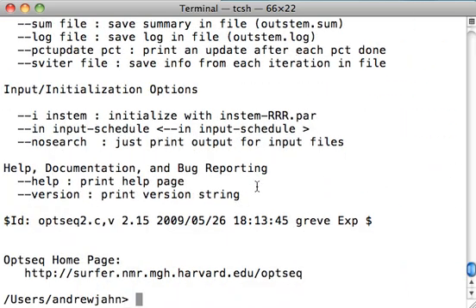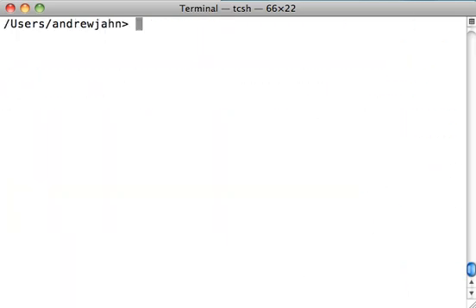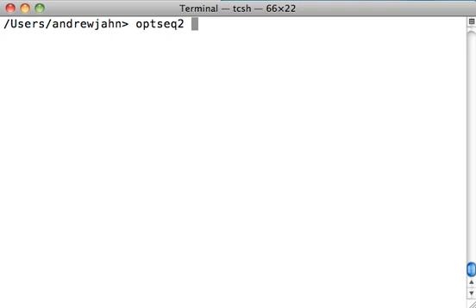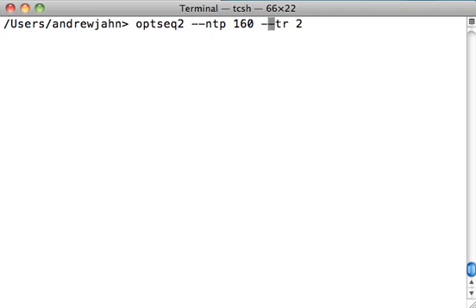Let's go through a very simple example of using OptSeq. OptSeq needs a few essential parameters. It needs the number of time points, the repetition time, and a series of the events or conditions that you have in your experiment. Let's do a hypothetical experiment which has 160 time points. For the number of time points, you type in NTP. They have all of this on their help file and in some of the exercises on the OptSeq website. The number of time points is 160, and the TR is 2. Notice that each of these options is prefixed by two dashes, two hyphens.